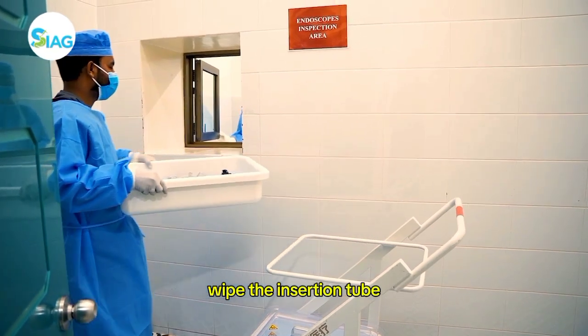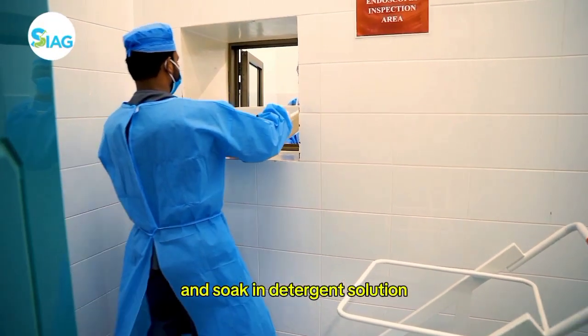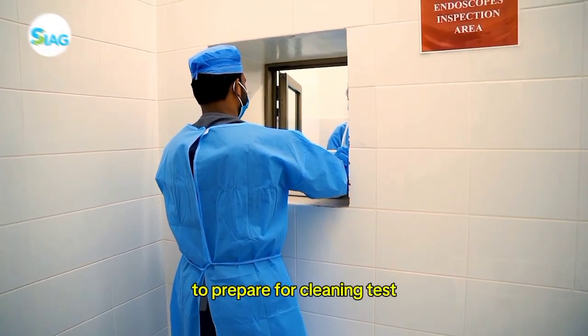Wipe the insertion tube, flush water and air through the channels, and soak in detergent solution to prepare for cleaning.